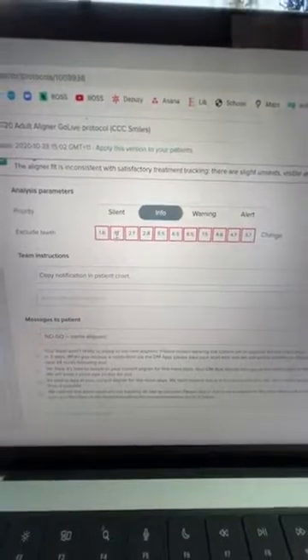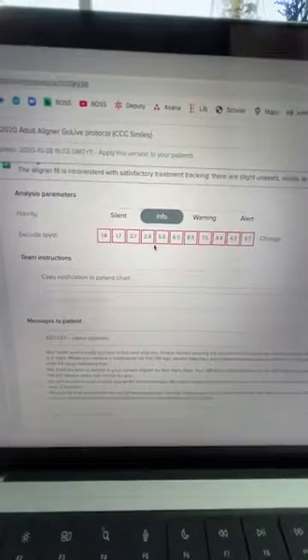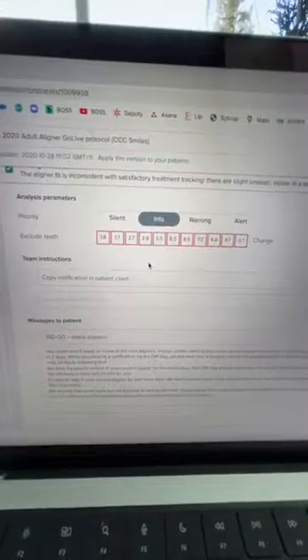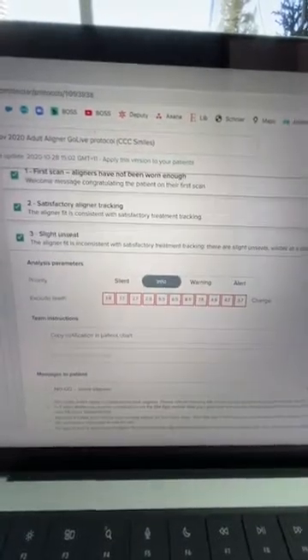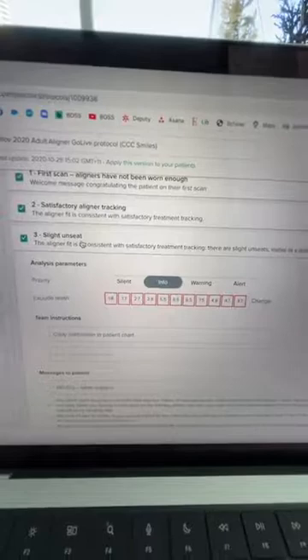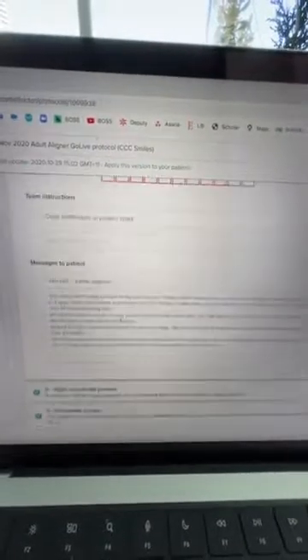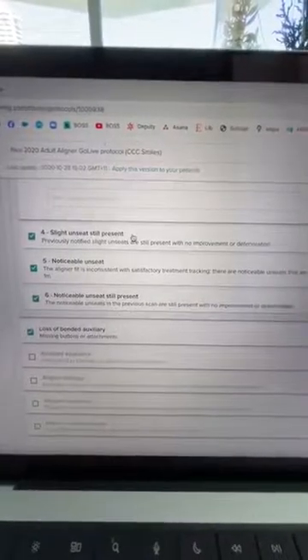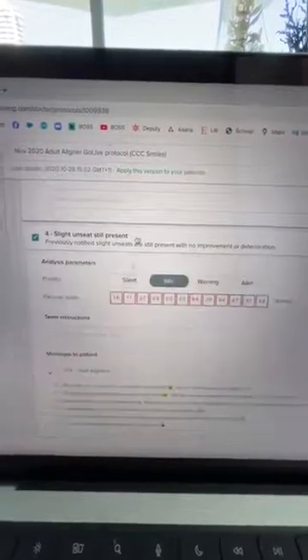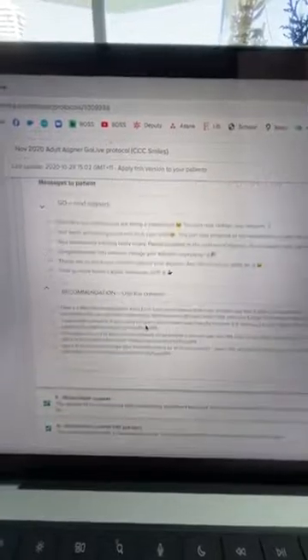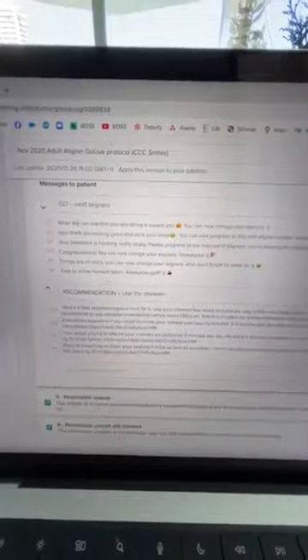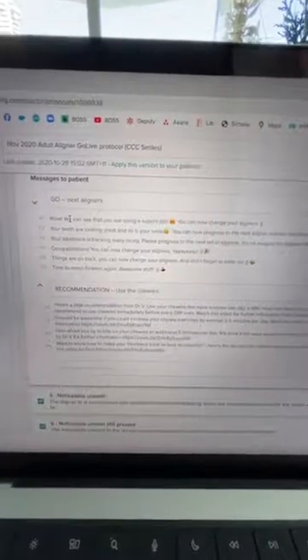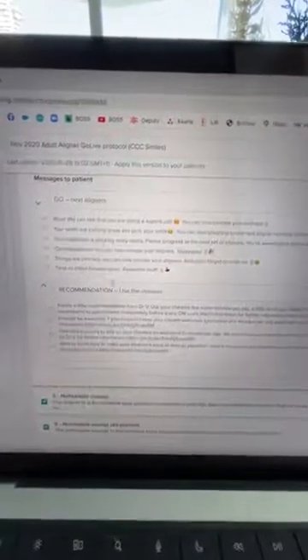I've asked dental monitoring to exclude 18, 17, 27, 28 - all your back teeth basically - because I'm not too worried if the aligner has an unseat slightly on the posteriors. I'm more worried about my anterior tooth correction. What if the slight unseat is still present in a subsequent scan? I've asked dental monitoring to ignore it.